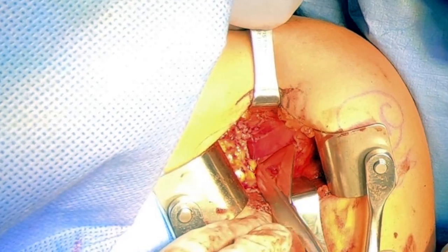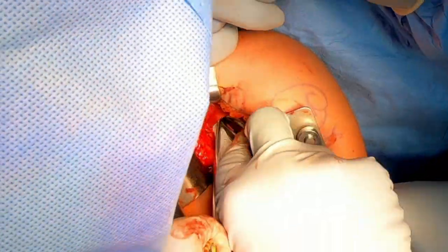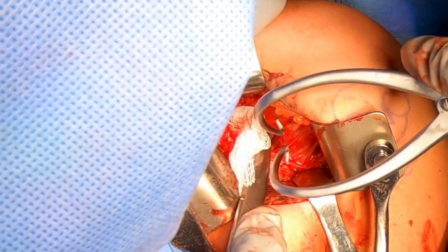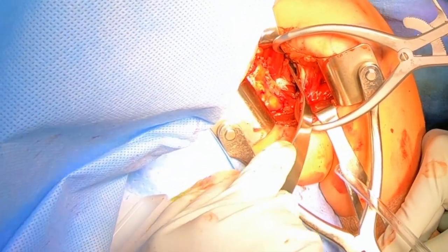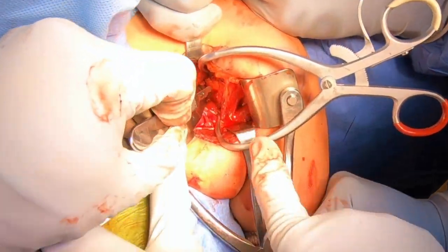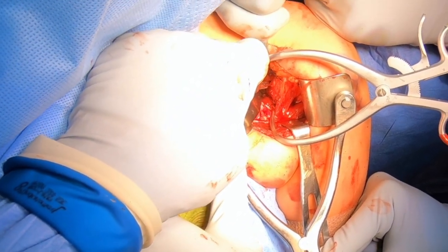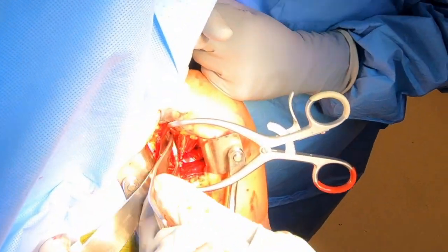To create a space between the subscapularis muscle and the capsule of the shoulder, you're going to see us push a Raytec through here to create that space. Once we get that sponge in place, we'll place our retractor — a blunt retractor — so we can see the capsule and make sure we don't do any damage to the muscle. We'll place another retractor so that we can see the capsule clearly, and once we can see it, we're ready to create our capsulotomy, which will give us access to the shoulder joint. This is a muscle-sparing approach, which I think is better for patients in their recovery.